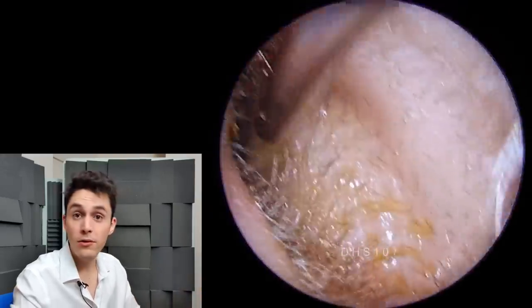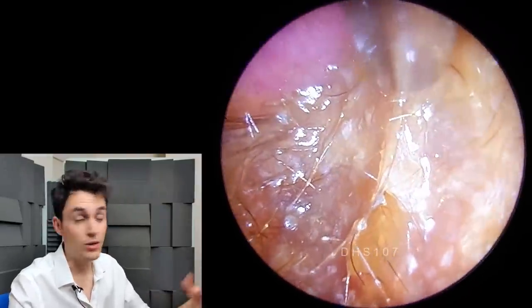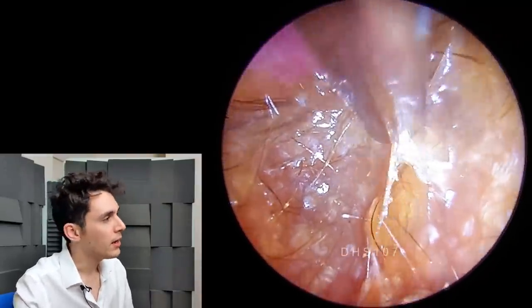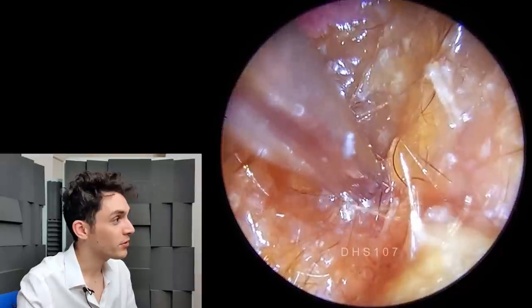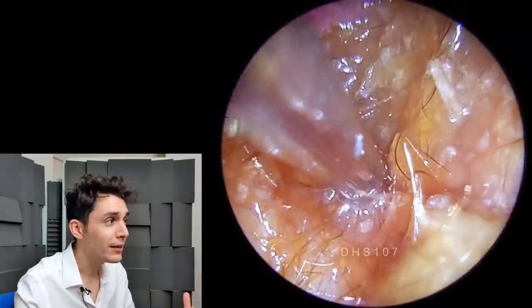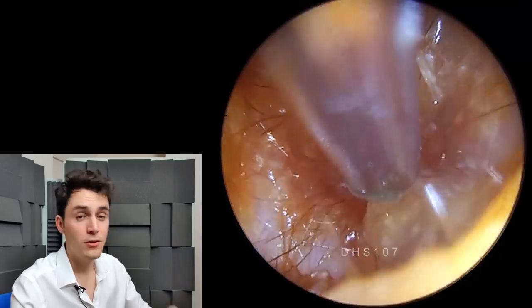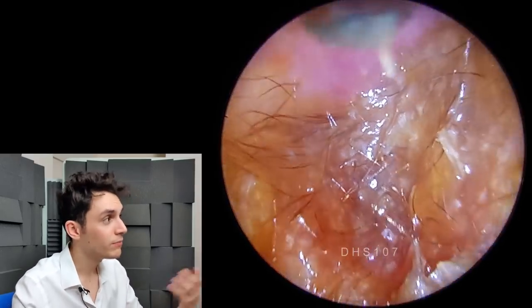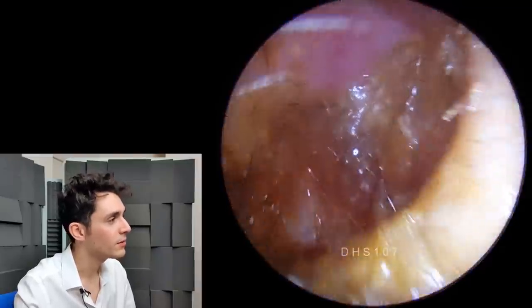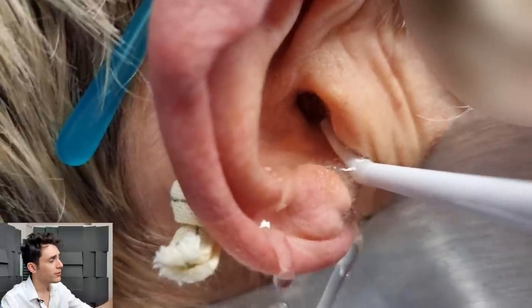It will also clear away a lot of the debris that I don't want to deal with and allow me to focus on the debris nearer the eardrum. I'm just trying my luck here to see if I can get any more position with the suction, but nothing's really sucking up. I could apply sodium bicarb and then do bicarb-suction cycles to try and cut through the slime, but that's time consuming. So here we see the electronic irrigator in action.